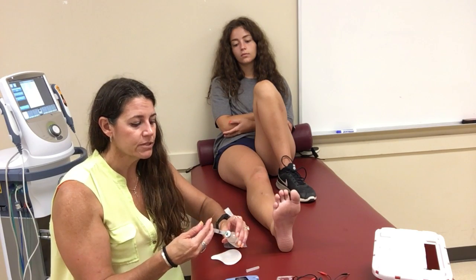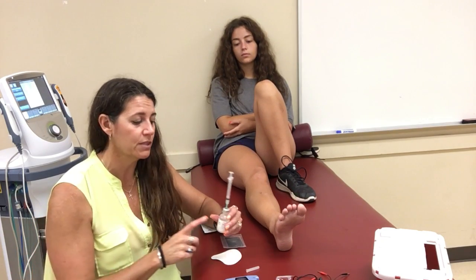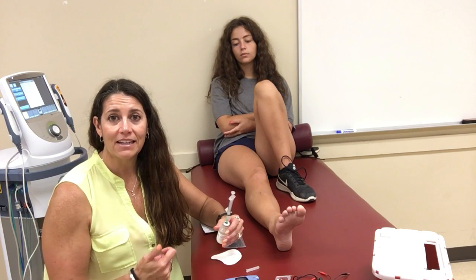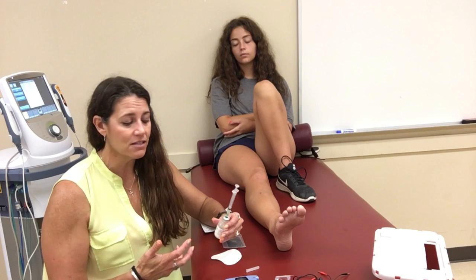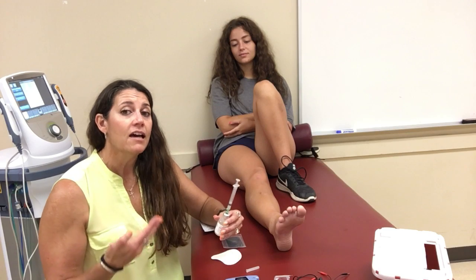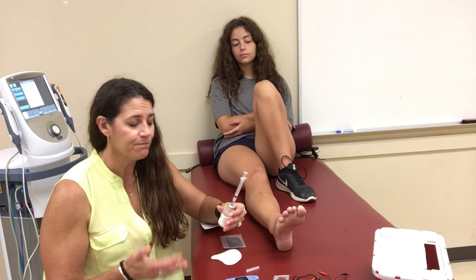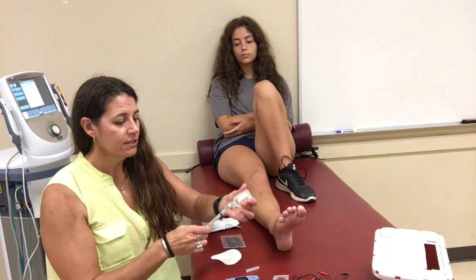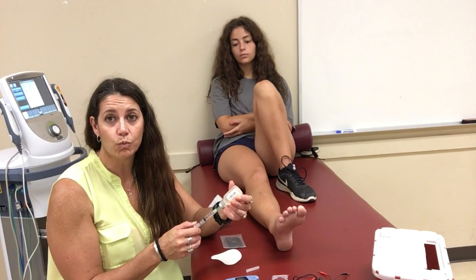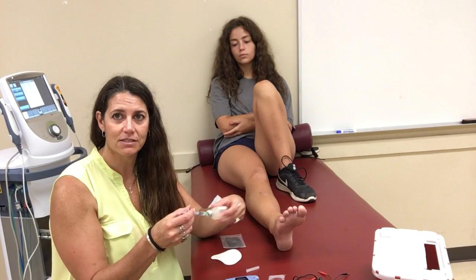The one thing you need to know about this treatment is that it requires a physician's prescription. The drugs used are dexamethasone, lidocaine, and hydrocortisone — you can't just buy these at CVS. You can also only perform a limited number of these treatments within a specific period of time, which we'll cover later. The maximum draw is two cc's; some doctors say one or one and a half.